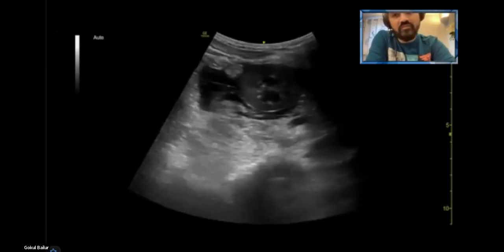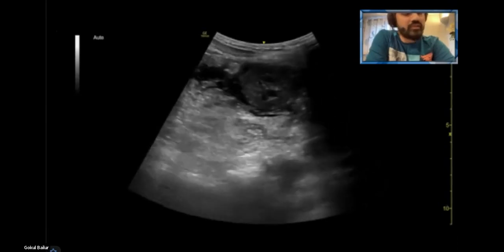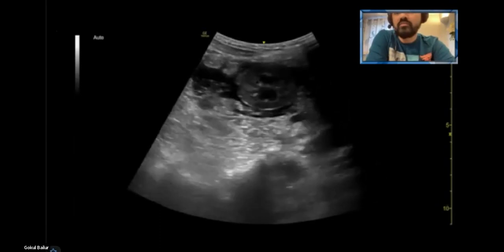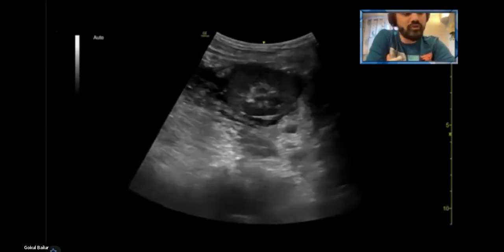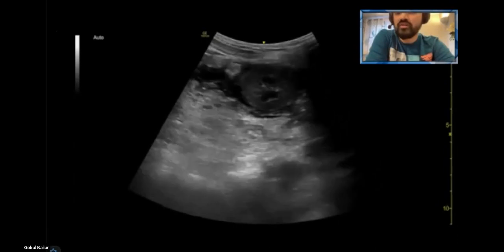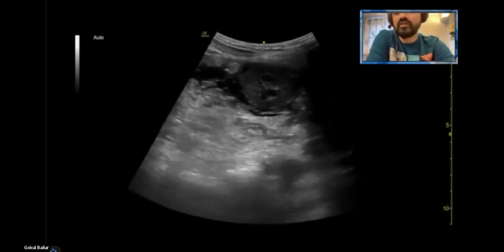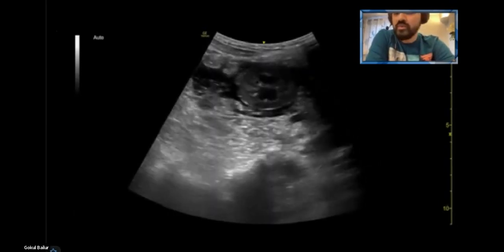And there was another 5 millimeter and a 2 millimeter stone. There was hydronephrosis of the right kidney with what they suggested might be inflammatory changes around the right kidney and possible urinoma. We spoke to the urologist who came down and saw the patient as well, based on obviously the CT findings and PoCUS findings.